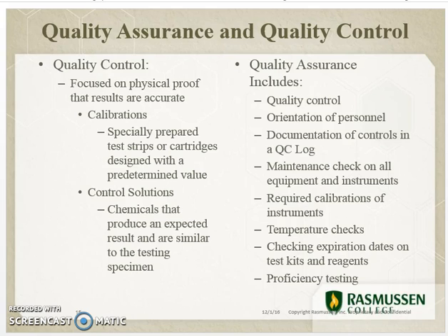Now, quality control is where we actually have a reference value that we refer to, or a normal value that we refer to, and it's focused on the physical proof that results are accurate. This can be done with calibrations or controlled solutions.